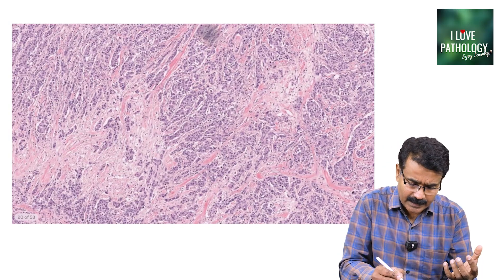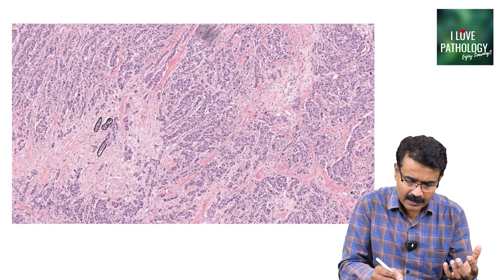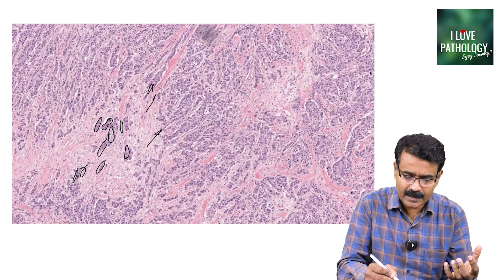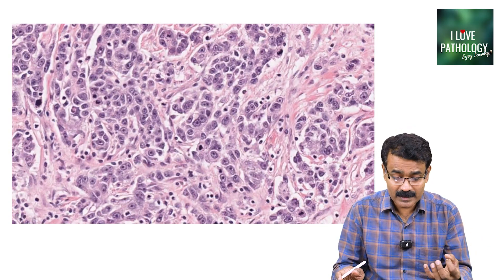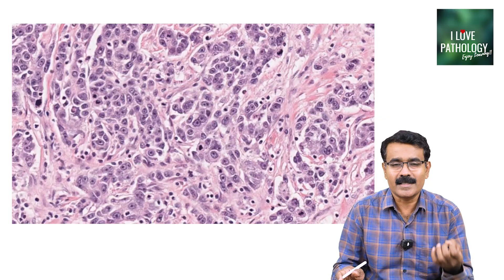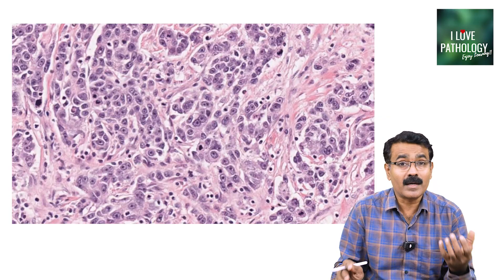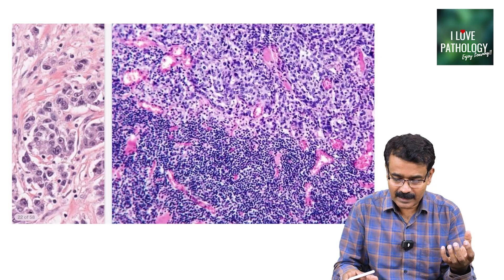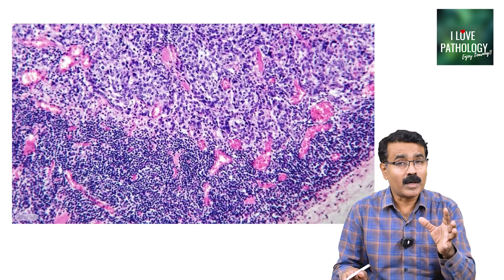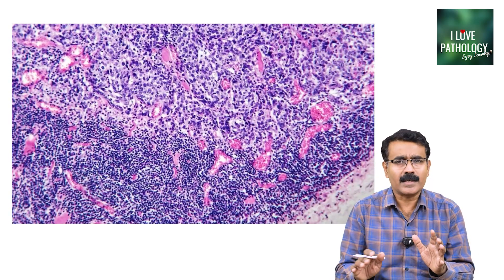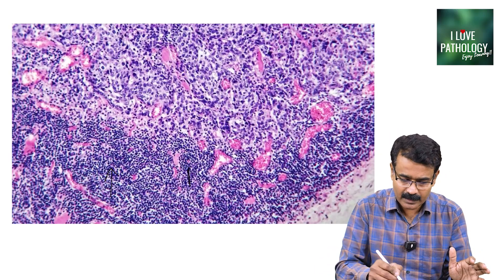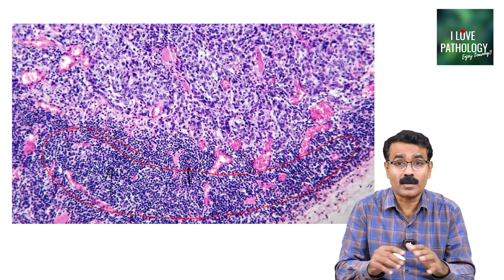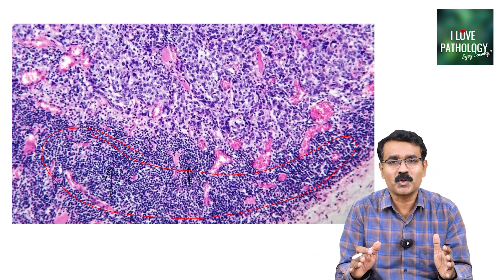At this magnification you can make out that the tumor cells are infiltrating into the stroma — these are tumor cells infiltrating into the underlying stroma. These cells are obviously pleomorphic, showing marked variation in size and shape of the cell and nuclei with prominent nucleoli, which are all features of malignancy. There is one important type of breast malignancy that grows in a sheet-like pattern along with dense lymphoplasmacytic infiltrate surrounding the syncytial growth pattern of the tumor cells.